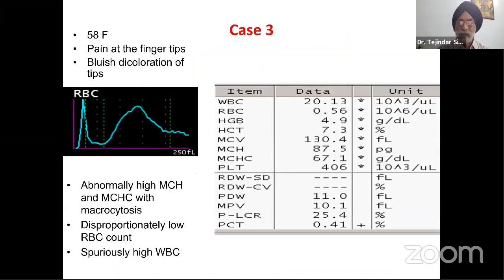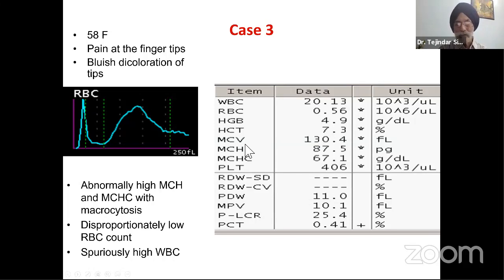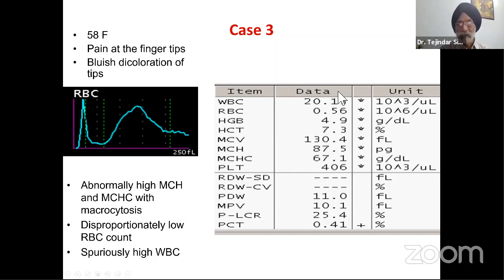The final diagnosis for case two was hairy cell leukemia. Case three: a 58-year-old female with pain at the fingertips and bluish discoloration. On the cell counter, WBC is high at 20,000, red cell count is very low at 0.5 million, hemoglobin very low at 4.9, hematocrit only 7 — disproportionately low for 4.9 grams hemoglobin. MCV is very high at 130, MCH around 90, and MCHC is going haywire at 67. Something is wrong — either the cell counter is not working properly or the sample is abnormal.